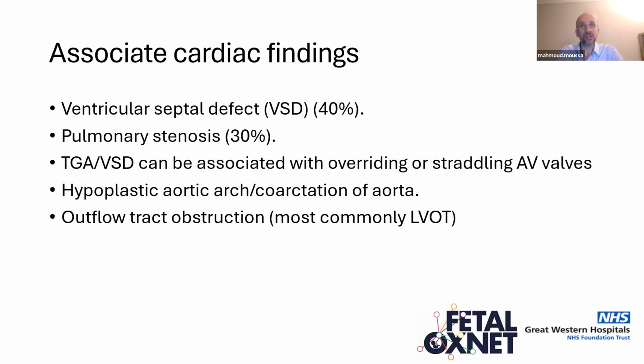The TGA is associated with other problems actually. Intracardiac, the commonest is the VSD, and actually it is important to check whether there is a VSD or not with the TGA. But there are other problems. The outflow obstruction sometimes is associated with it, and again, it's mainly on the left side.